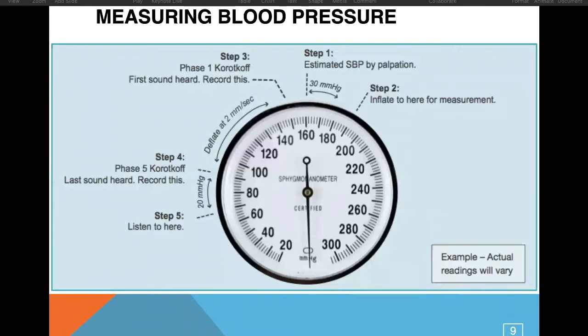So we're going to inflate the cuff, and then we are slowly going to release the pressure with a dial that's on the bulb that we use to inflate it. I like to refer to that little dial as something of a stick shift in a manual transmission for those of you who have driven stick shifts. Every clutch engages a little bit differently, and with every blood pressure cuff, that dial comes down at a slightly different speed. So you have to have a sensitive touch on the dial in order to get a nice, smooth descent of that needle as it comes down.